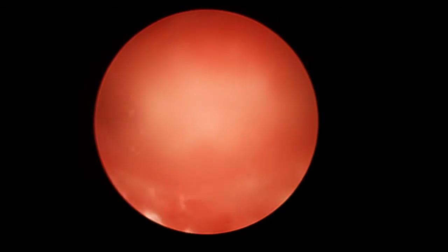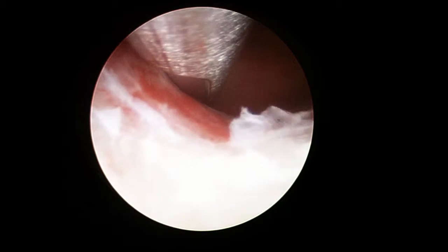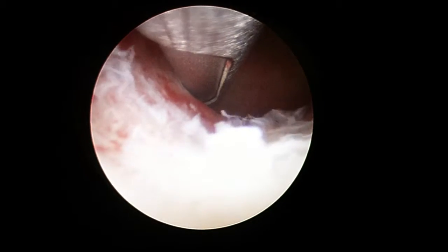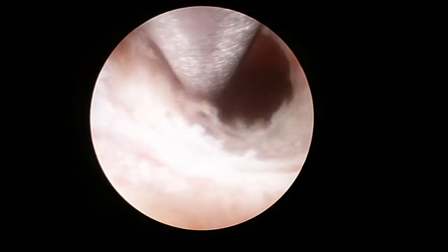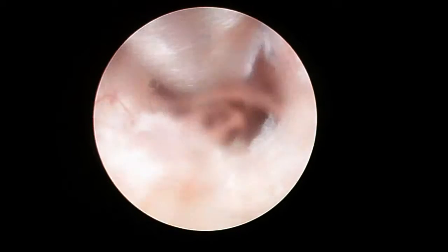The upper uterine cavity is now entered. Intrauterine adhesions were first described in 1948 by Dr. Asherman. Damage to the basilar layer of the endometrium, such as with curettage, can lead to intrauterine adhesions. And cases of patients with adhesions within the uterine cavity have been reported in women undergoing treatment with tamoxifen.